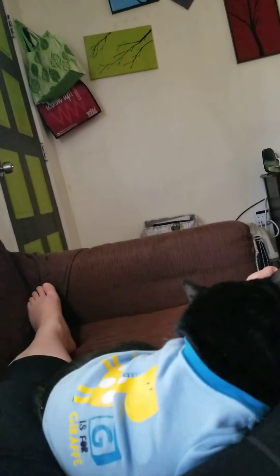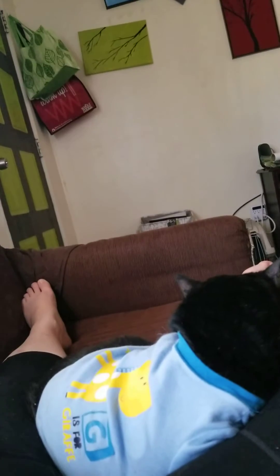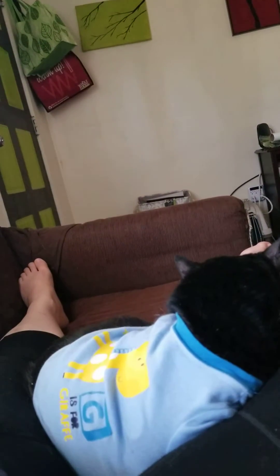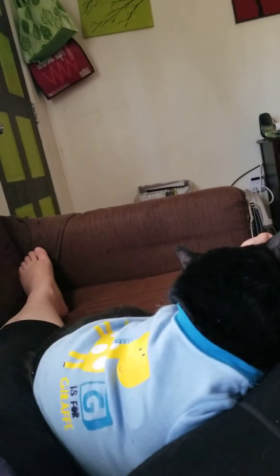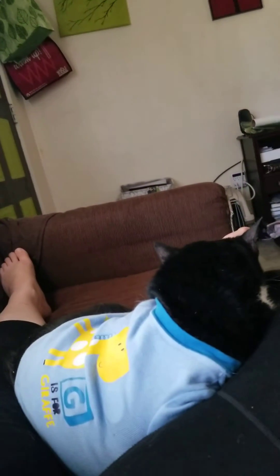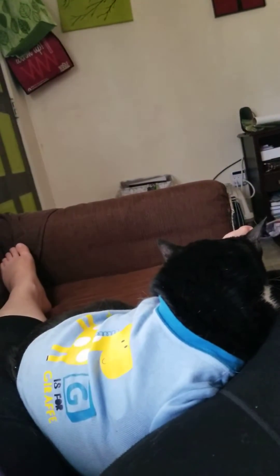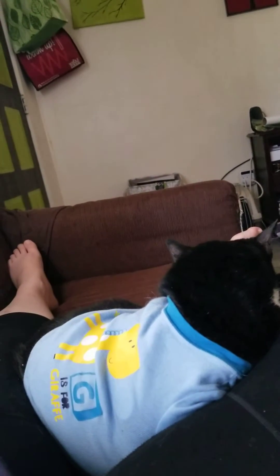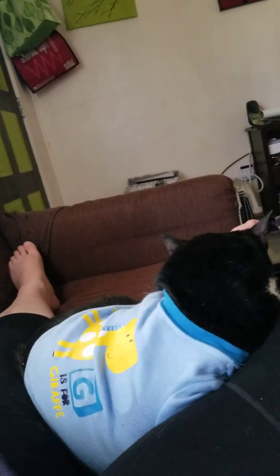Hello everyone — you can't see my face because it looks terrible today, but I wanted to do a quick video just to show you guys how easy it is to check a cat's blood sugar when they have a Freestyle Libre sensor implanted and then using a monitor.